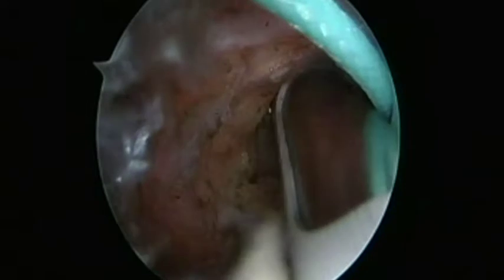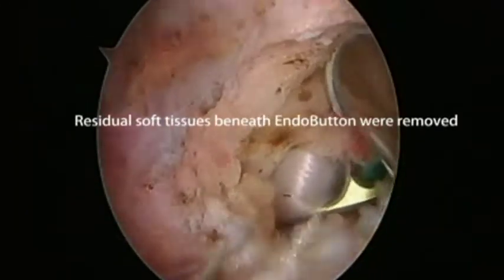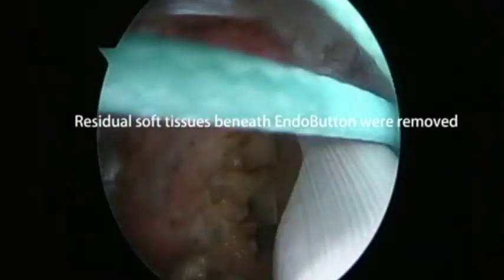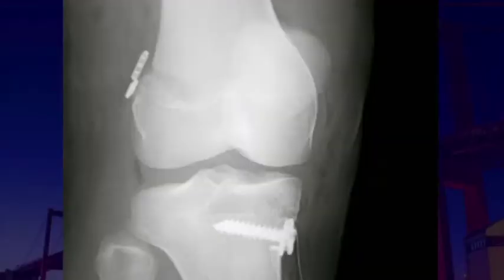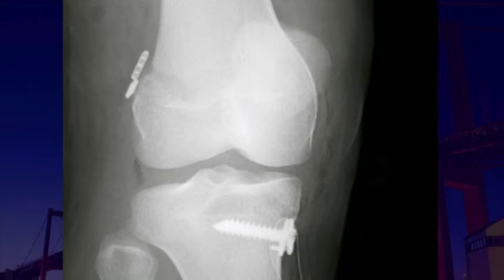Residual soft tissue beneath the endobutton was removed again. The post-operative X-ray was obtained to confirm the position of the endobutton after ACL reconstruction.